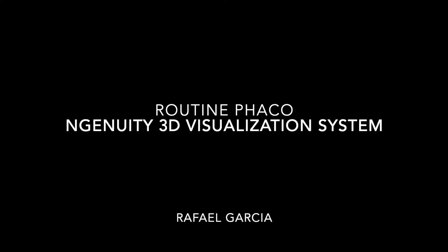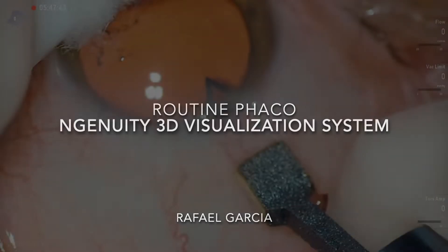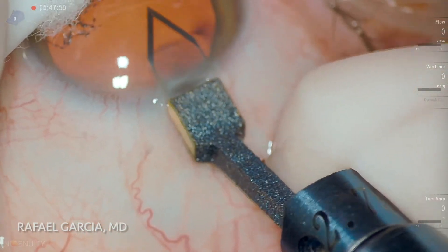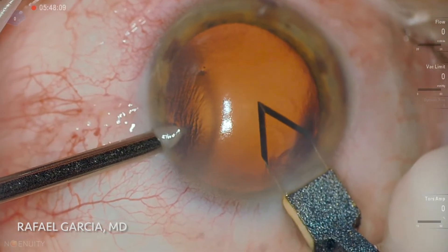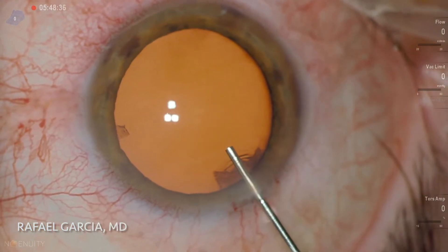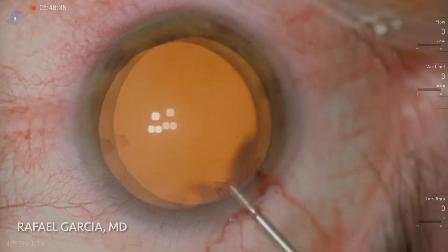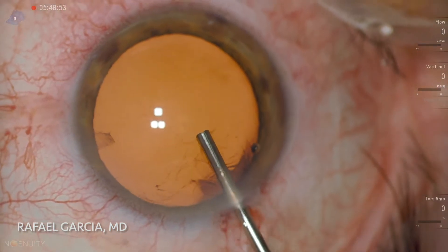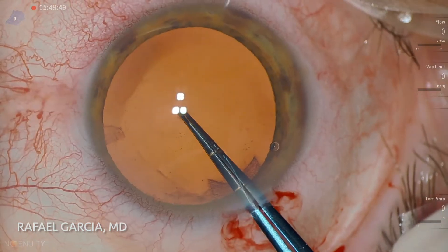This is a routine cataract surgery performed with the Ingenuity Visualization System, a digital 3D viewing system developed by Alcon. In this surgery we are not looking through the microscope binoculars. Instead, we are doing what has been called heads-up surgery, wearing 3D glasses and looking straight to a high-definition widescreen display.